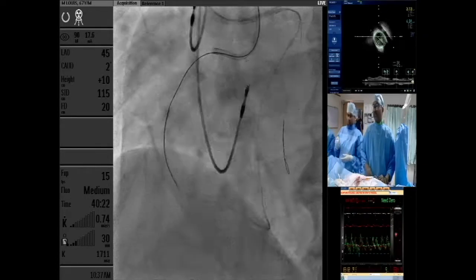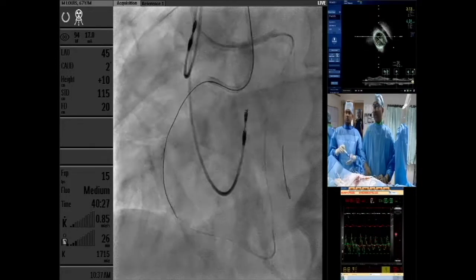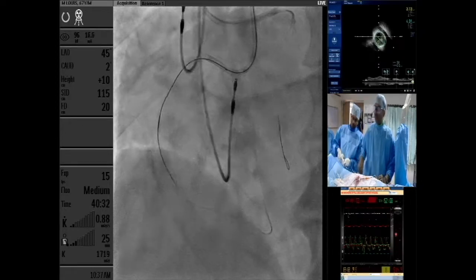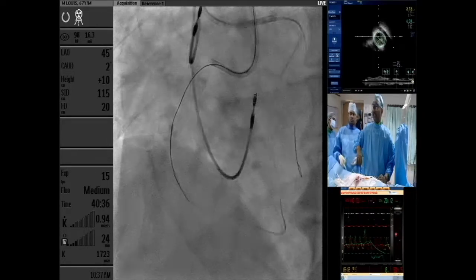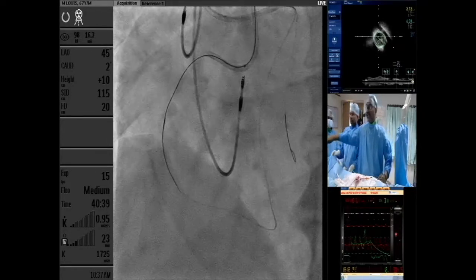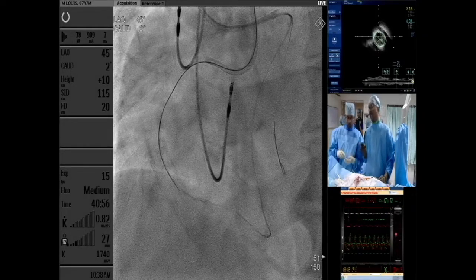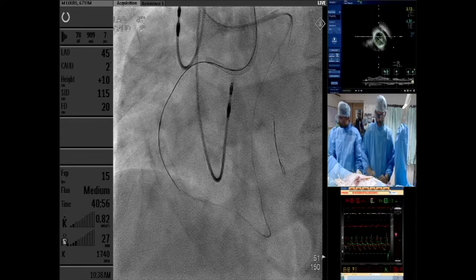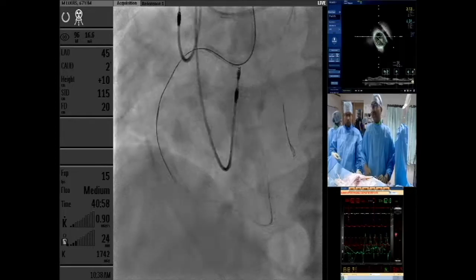So this is a 2.5 trapper balloon. So we are trapping the antegrade wire. Yes, trap please. Yes. Yeah. Yes. Give me guideliner, 6 is better actually. 7 never use. Even in any situation by default use only 6. The only thing is, you know, air embolism. But okay, anyway, we are not injecting, right?